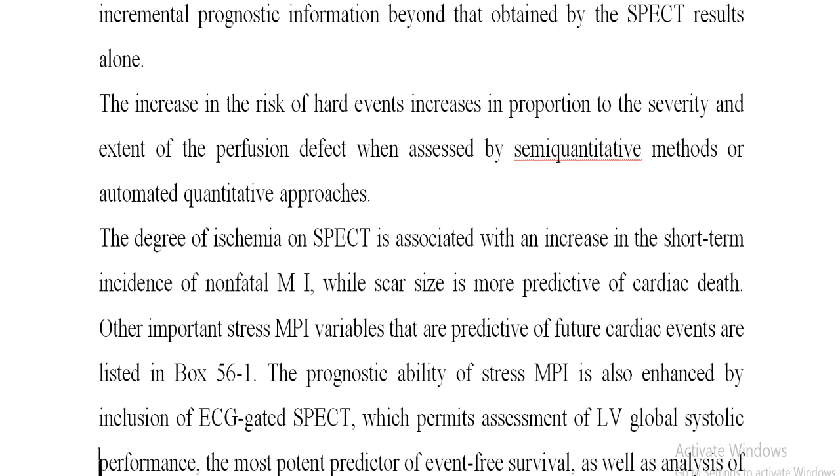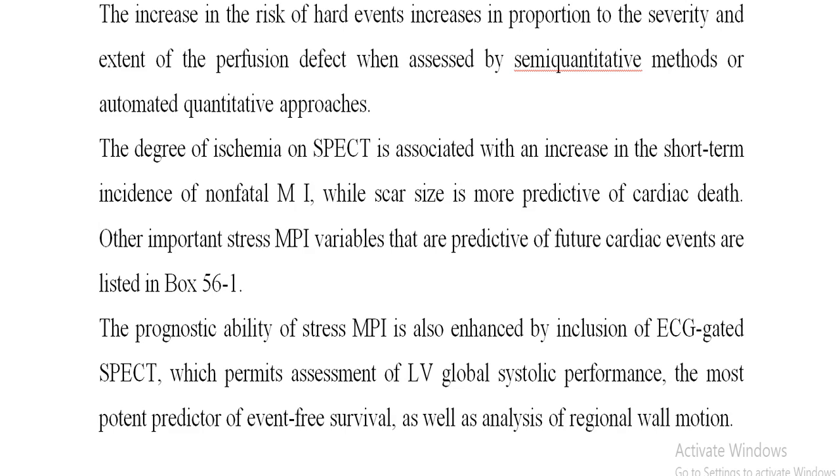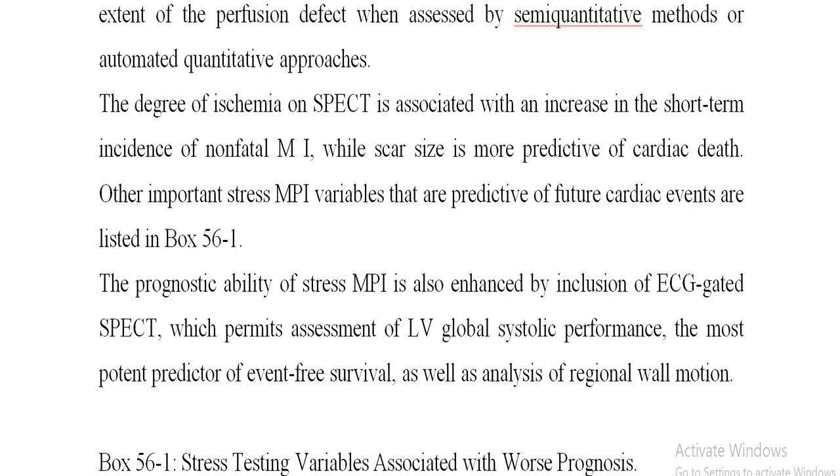The prognostic ability of stress MPI is also enhanced by inclusion of ECG-gated SPECT, which permits assessment of LV global systolic performance, the most potent predictor of event-free survival, as well as analysis of regional wall motion.